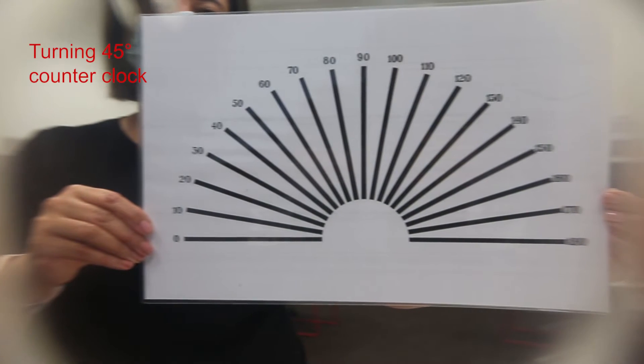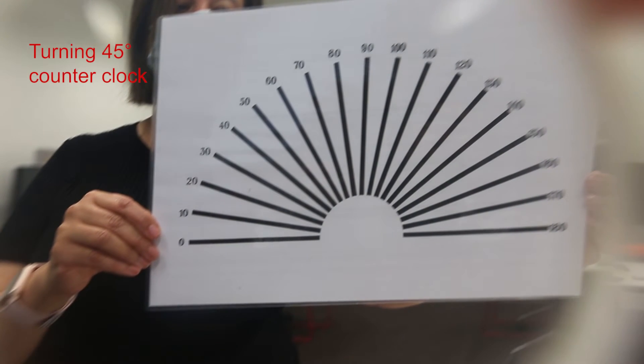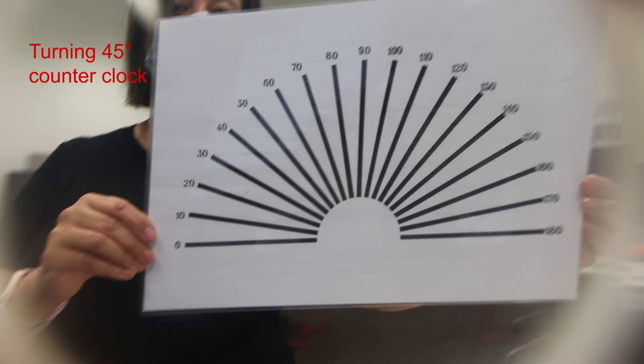Now we'll rotate the lens through 45 degrees counterclockwise. We've now completed the rotation. Did you notice any changes in the focus of the lines? In which case make a note.